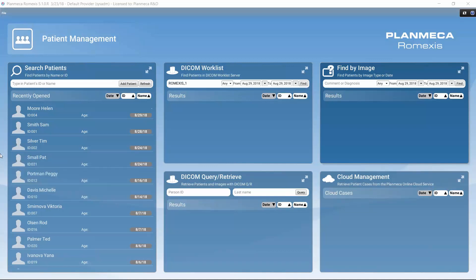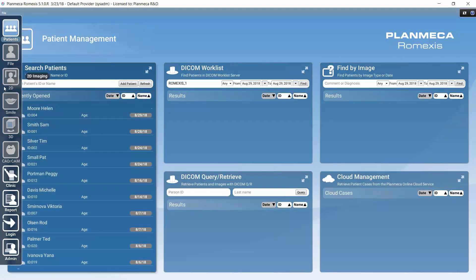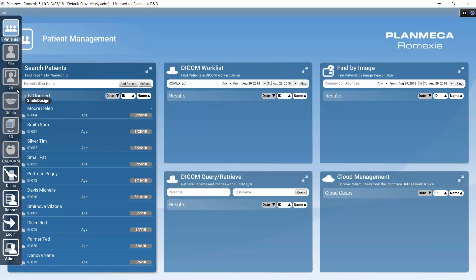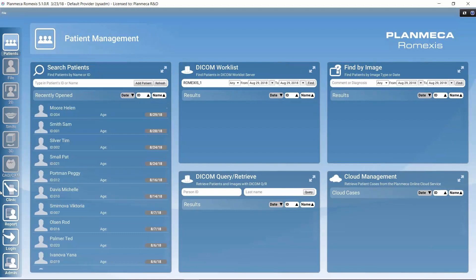Bringing the mouse to the left of the screen reveals the module bar, which displays all modules in Romexis and serves as navigation between them. To keep the module bar continuously visible, right-click on it and select 'Turn hiding off.' The selection of modules depends on the license being used, so not all modules may be visible — for example, with only a 2D imaging module license, only that module appears.